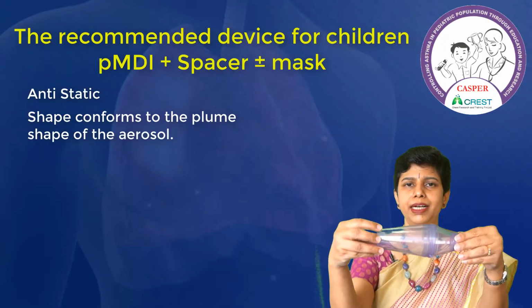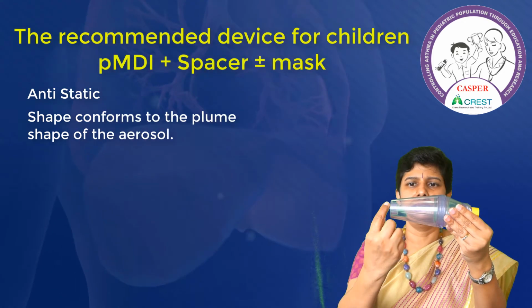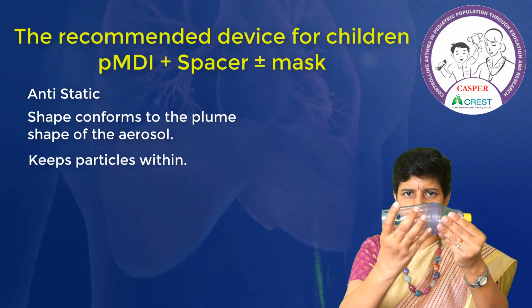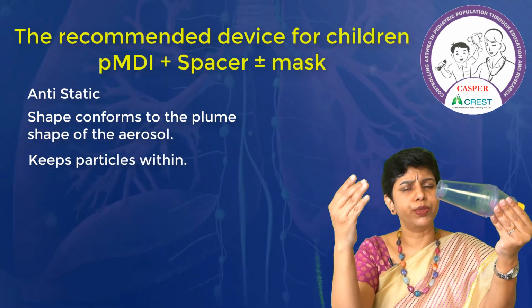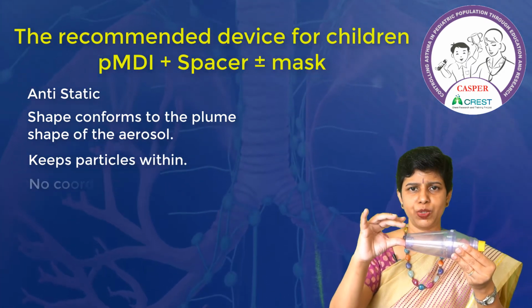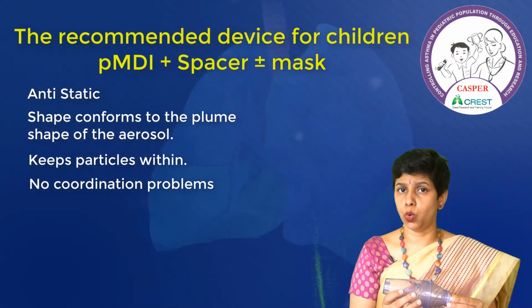The other advantage of the spacer is that it acts as a holding chamber. It keeps the drug suspended inside itself so that there is no rush of actuation inhalation coordination, and the drug can be actuated in this and inhaled at one's own pace.